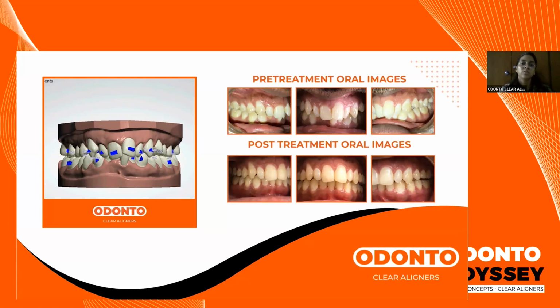So what sort of treatment modality is an option in this patient? A sort of proximal reduction will be required for this case. It will be done sequentially in multiple stages because we do not have good contacts to start with right off the bat, that we can just start removing tooth material from all contacts and then just bring them in line immediately.